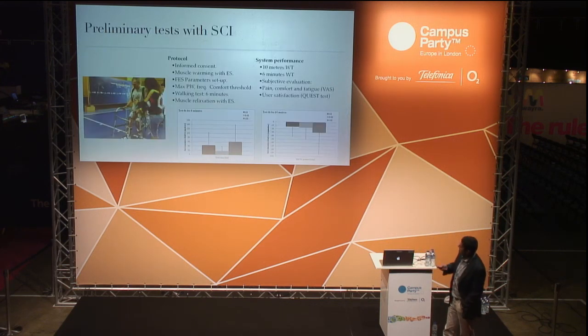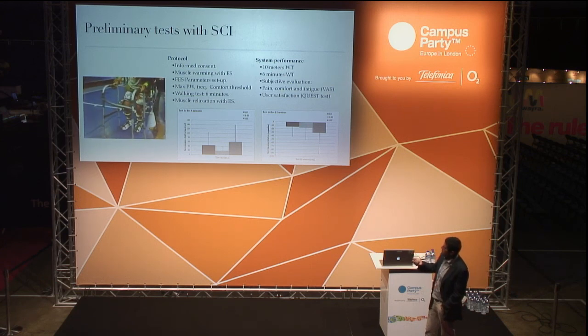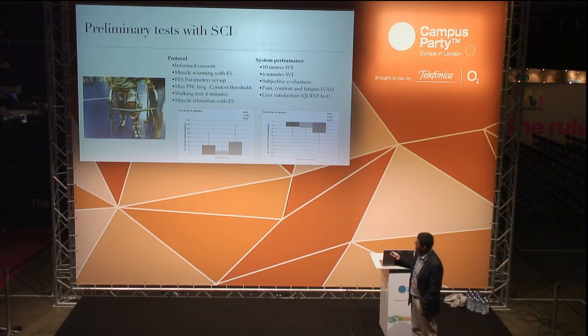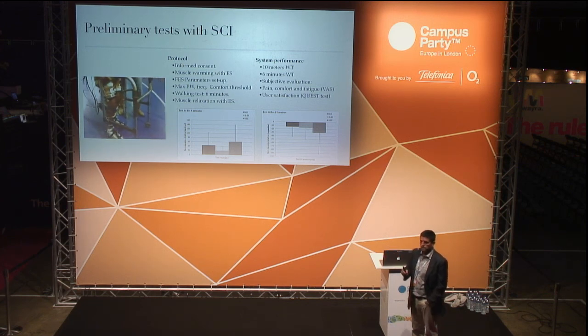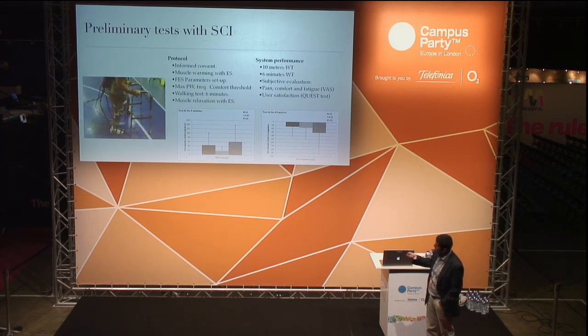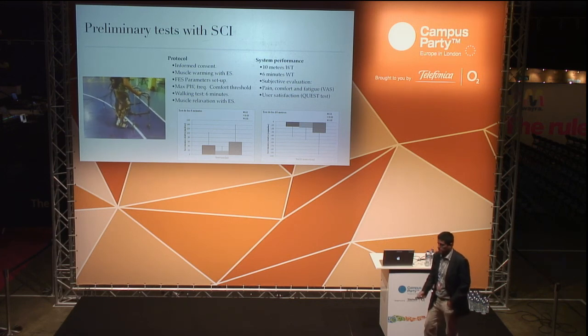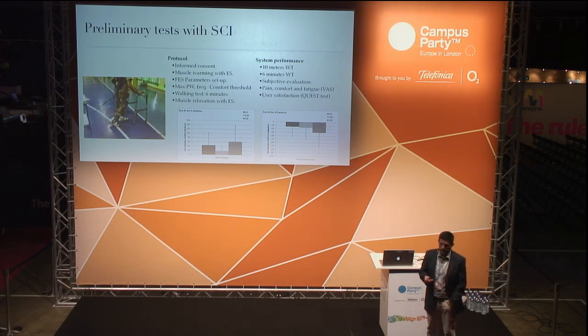Okay. I will skip this. This is just the example that you saw before. This is in a hospital training lab. So the user has a low-level spinal cord injury, so he still has some control at the hip level, but he has lost control at the knee and ankle levels. So he's using this walker here just for stability and to keep balance. And the system is assisting this patient, either by means of the exoskeleton or by means of the electrodes that are placed mostly in these muscles here, while walking during one of the training sessions.